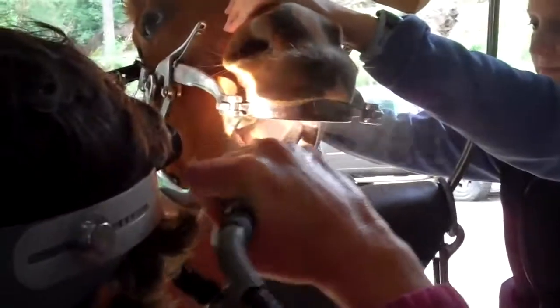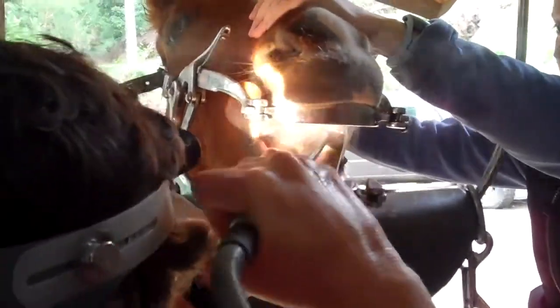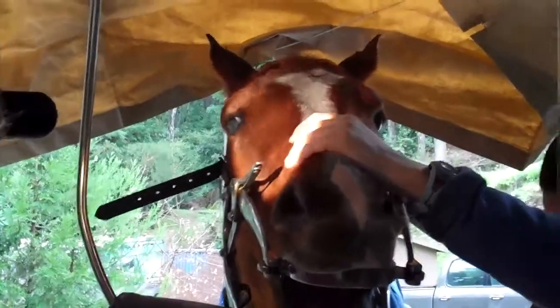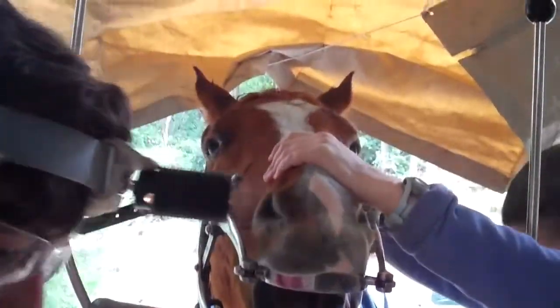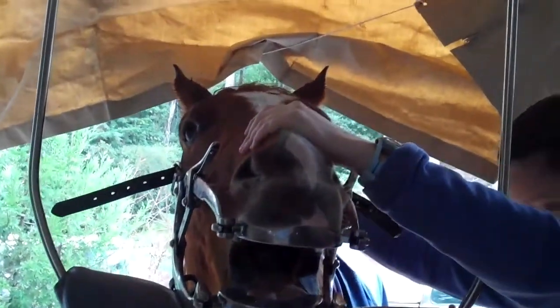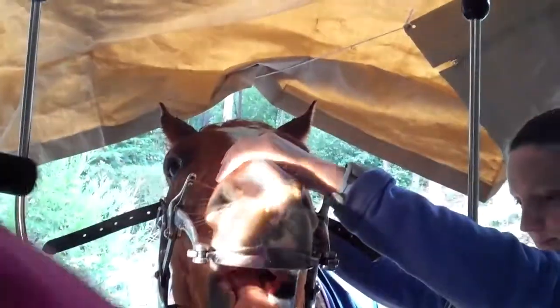You want me to try vacuum? What do you think? How sedate does she seem? Not very sedate. Okay, let's skip vacuum — because she's sound sensitive, we're going to just deal with it. We hope that we don't have to re-dose her, though we might have to anyway.